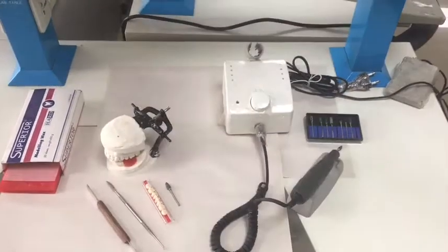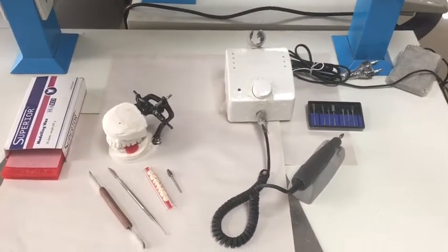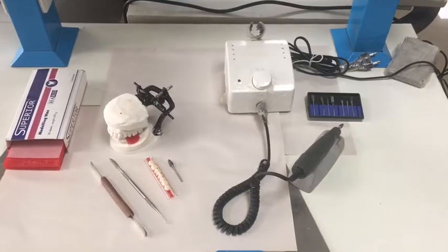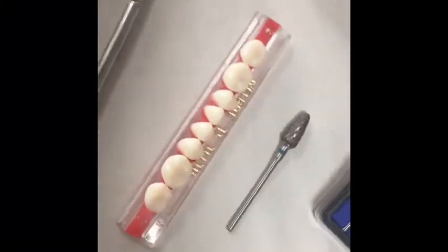Hello students, today we will be giving you a brief demonstration on teeth setup for partial denture. First of all, take out the acrylic teeth strip that you have and see which teeth need to be replaced in your case.